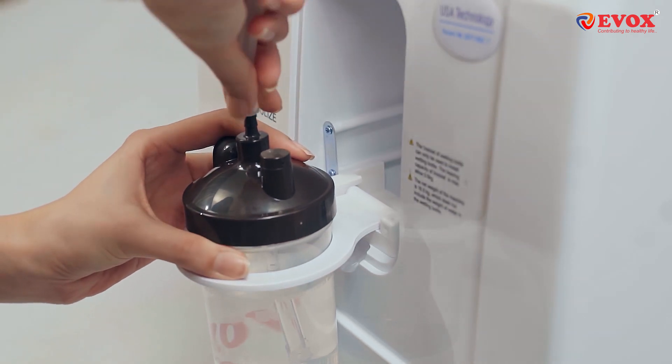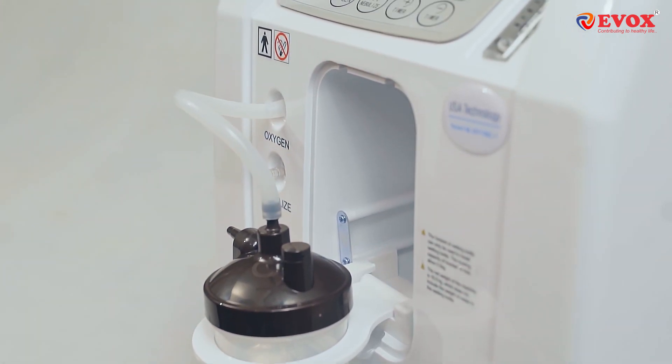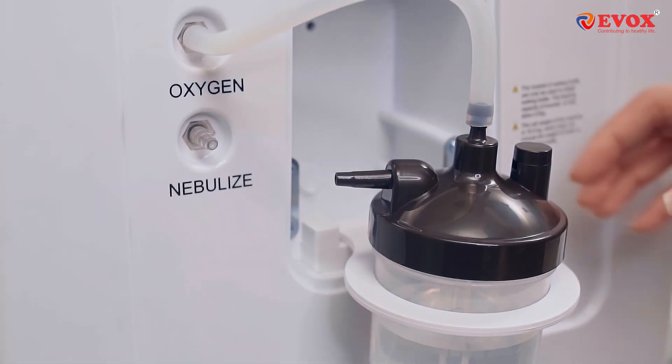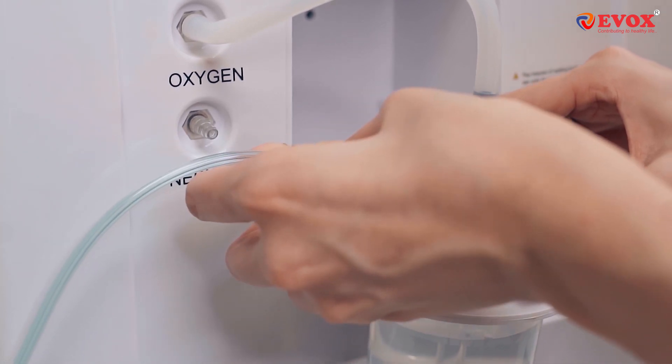Once the humidifier has been placed, we'll attach the connecting pipe to the Oxygen Outlet Nozzle. After connecting to the Oxygen Outlet Nozzle, we'll connect the breathing tube to the nozzle on the humidifier.